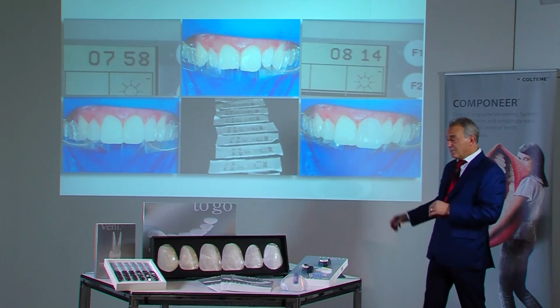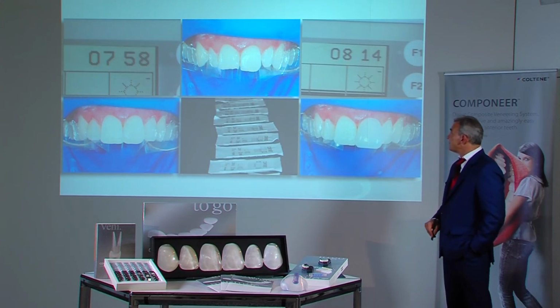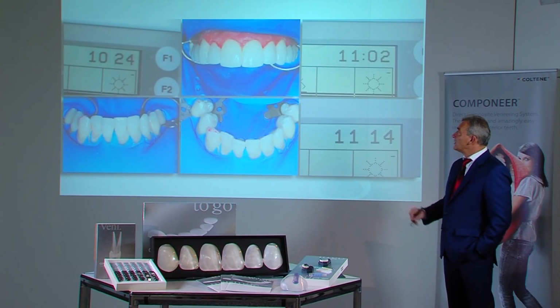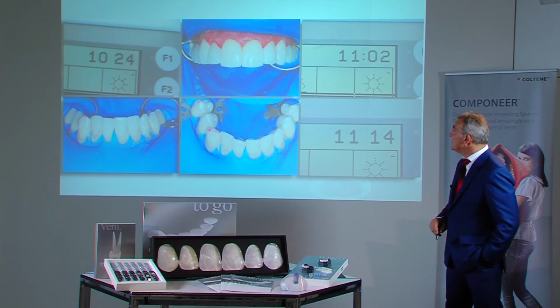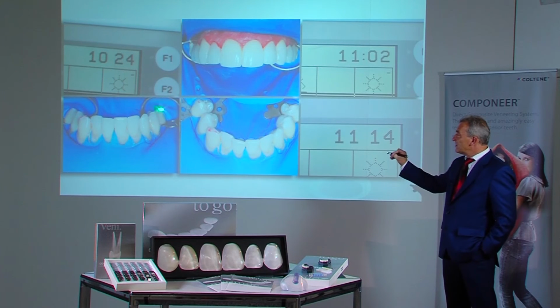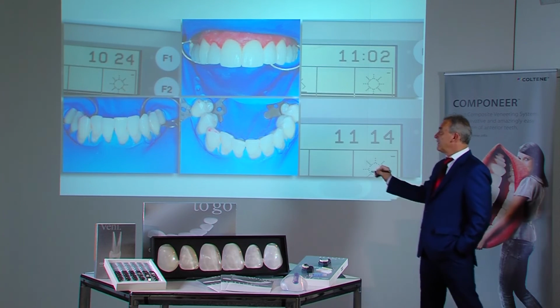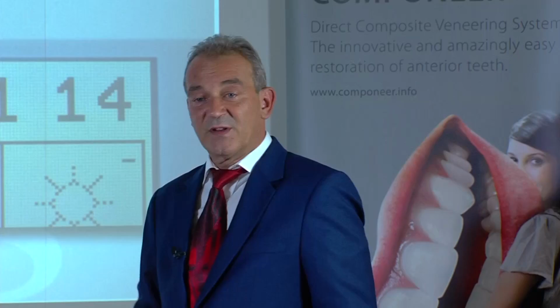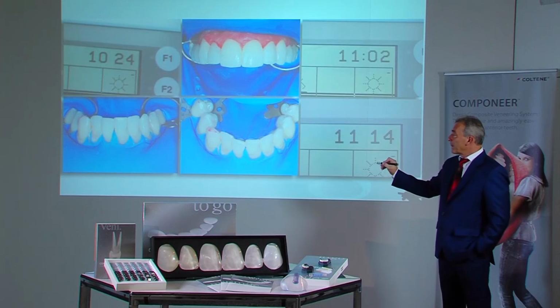Here we see the try-in of componeer. Time has progressed considerably, and 3 hours later, the 10 componeers are placed on the surface and worked up. We take a small break, and the mandible is isolated differently. The holes of the rubber dam were cut somewhat larger buccally to then glue the rubber dam to the gingiva with histoacryl.